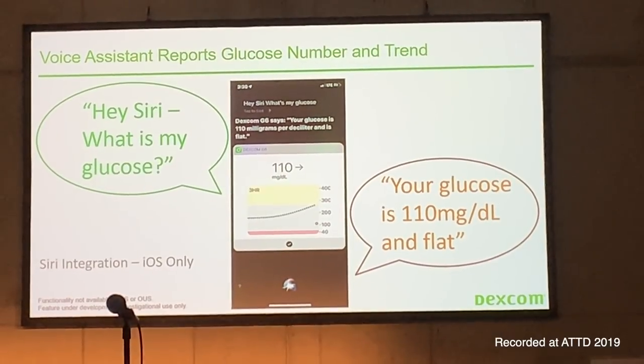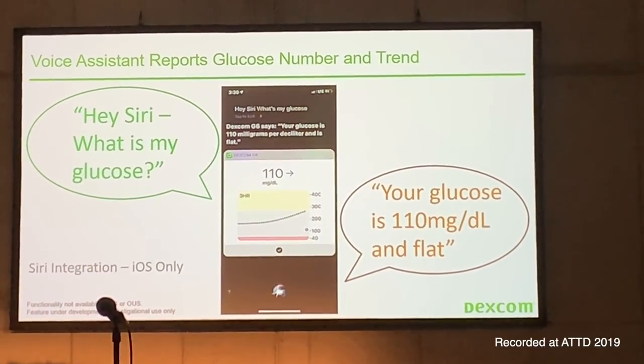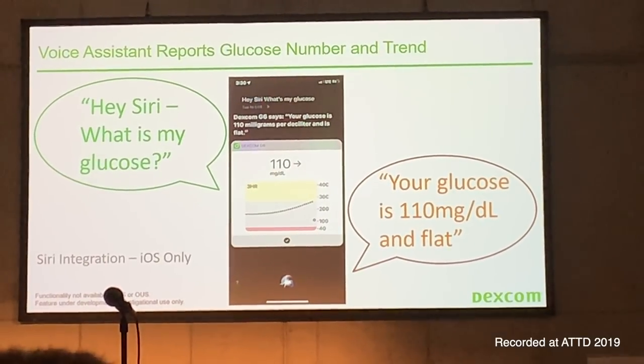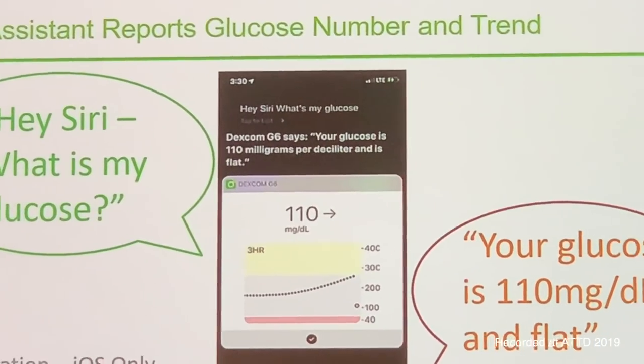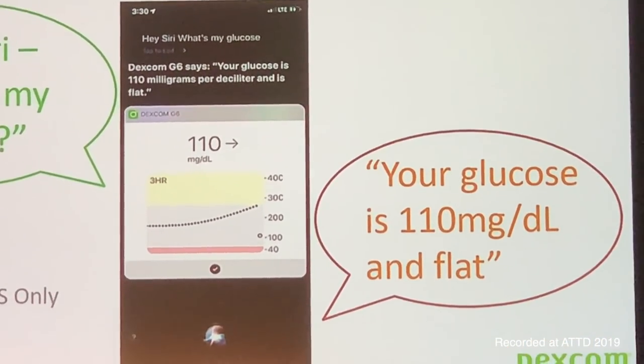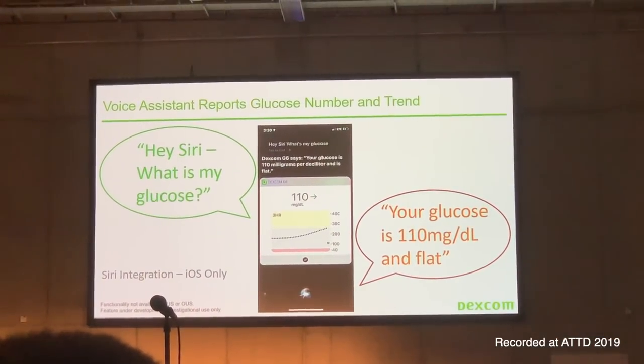And Siri will repeat back glucose value and trend, which is particularly important. Imagine the use case where somebody is driving and they don't want to pick up their phone and be distracted, so they could simply say, "Siri, what's my glucose?" And they'll be informed of what their glucose value is, as well as the trend arrow.